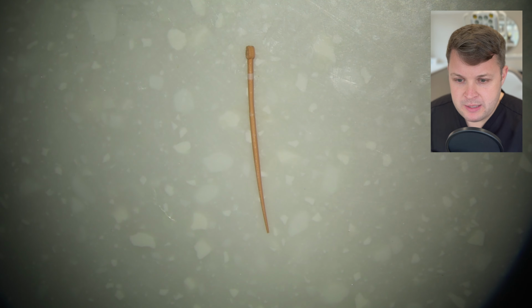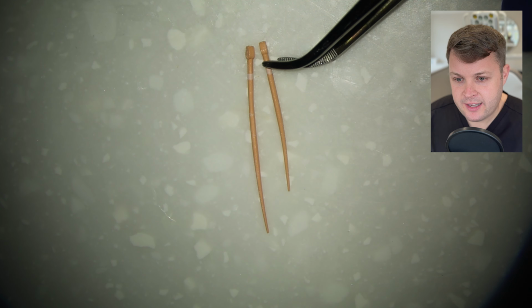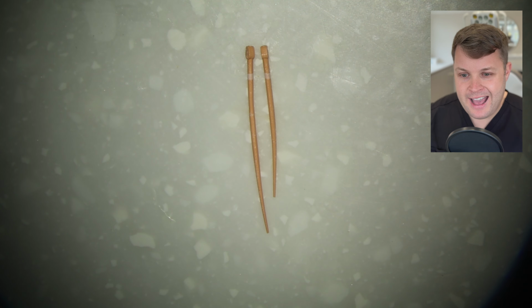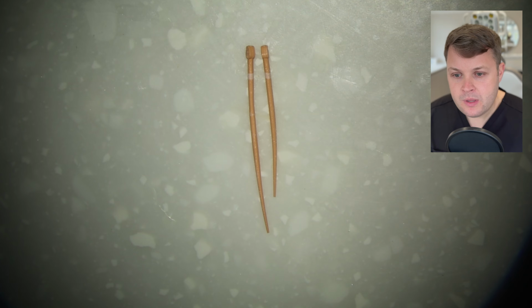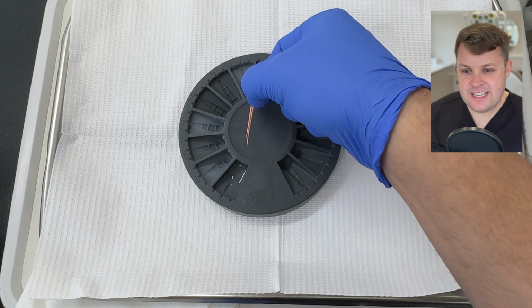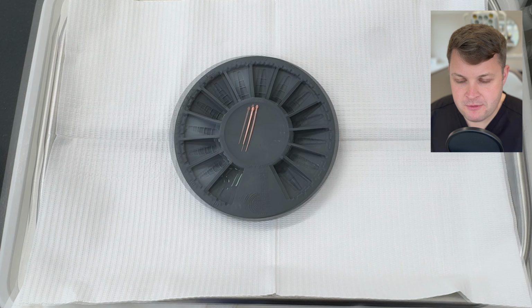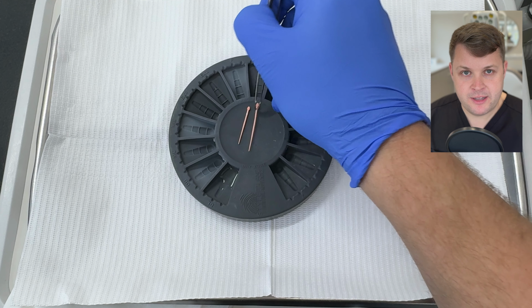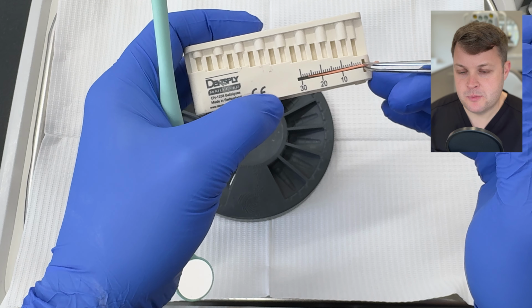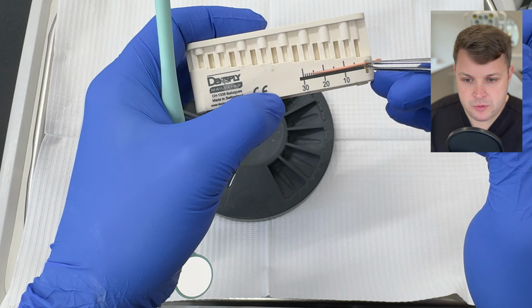And if we place it next to another, original GP cone, you can see that we've now got that extra length. So we've now got an extra long GP cone, and we are ready to place it into our canal. I'm going to place the two GP cones in this little deep GP disinfectant ring. Of course, we're going to disinfect this GP cone later, and we can see here that there's plenty of length for us to push it to length.